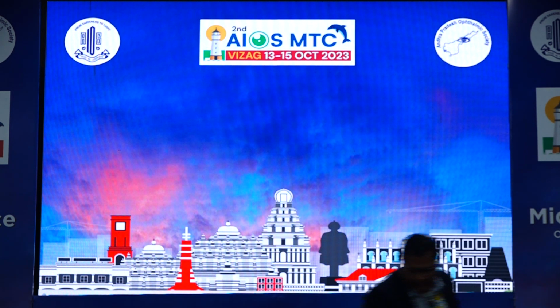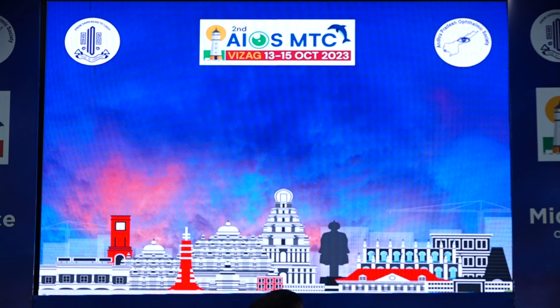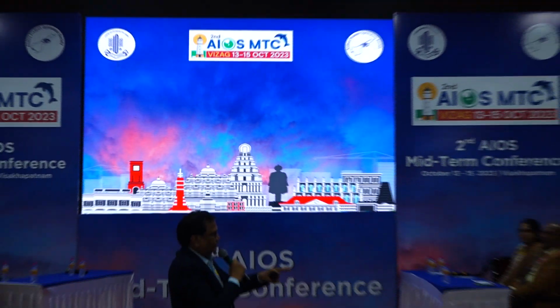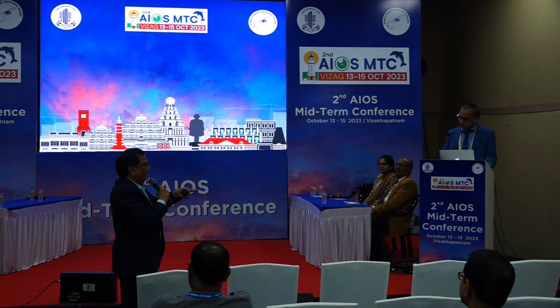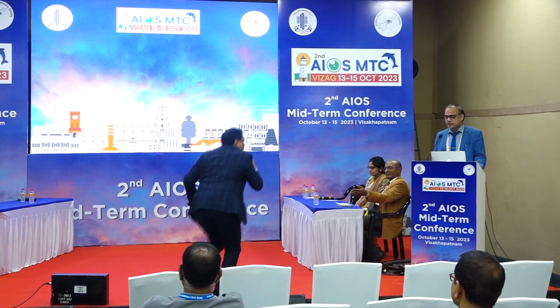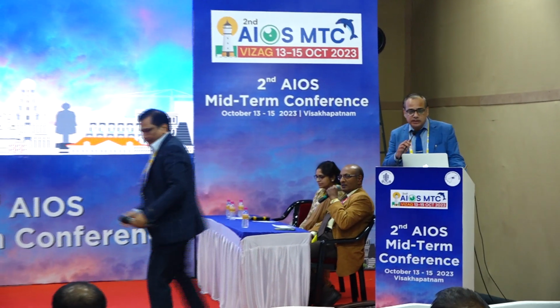In pseudo-exfoliation, generally because of the zonular weakness, we avoid hydrodissection. Completely no hydration, no rotation, and most of the time we have to remove the pieces in situ and just lift them out of the bag. That's mainly the trick to avoid making the zonular weakness worse.